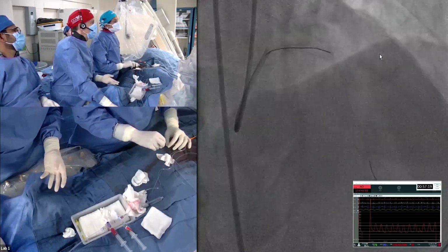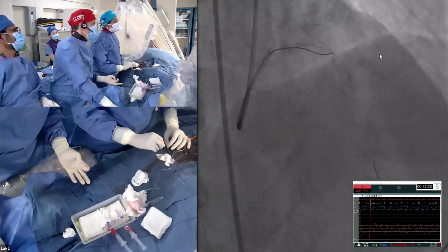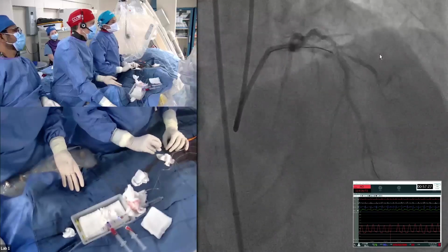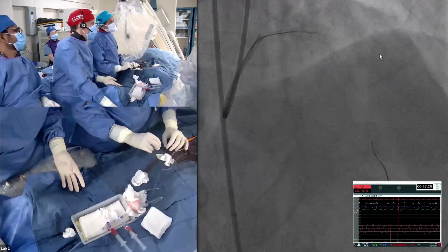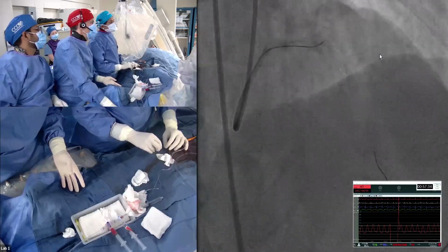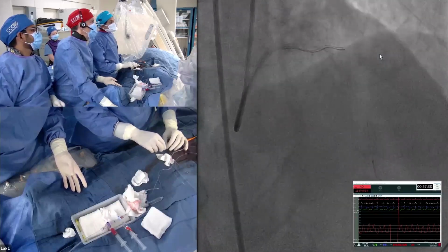Sanjeev: I would like to wire the diagonal and then do the ballooning or a cutting balloon and see if there is no dissection, then make it a provisional stent, and then do kissing. Subsequently, you can do kissing with the DCB. You want imaging or no? Yeah, imaging first to the LAD. Okay, first to the LAD.